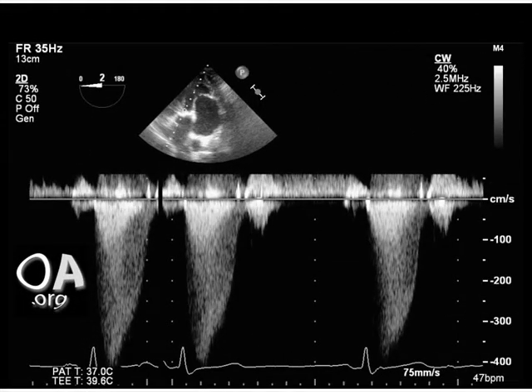This is an example of the flow profile obtained when the continuous wave Doppler beam is aligned with the flow of blood exiting the left ventricular outflow tract through the aortic valve into the aorta. This is again the deep transgastric view. The velocity scale is seen along the right side of this image, and from an initial view, the greatest velocity noted here is approximately 400 centimeters per second, consistent with severe aortic stenosis.